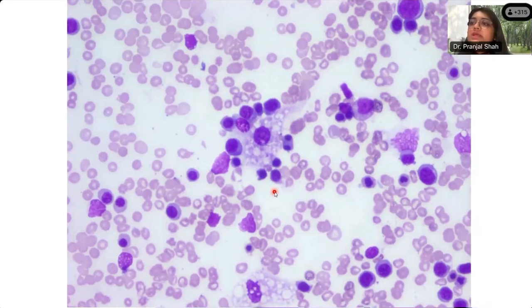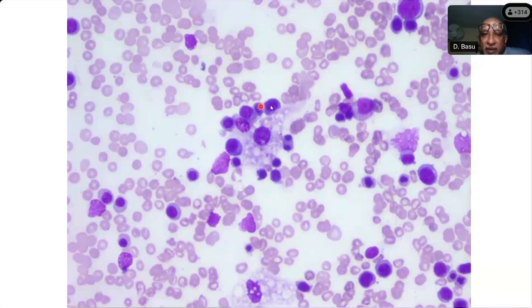And there is erythropoiesis happening around these macrophages, and that's normal. That's how the erythron is formed. There is a central nursing macrophage which gives nourishment, surrounded by erythropoiesis. The same thing is recapitulated here, except that these macrophages look a bit odd. That's not really normal. They have very punched out vacuoles.